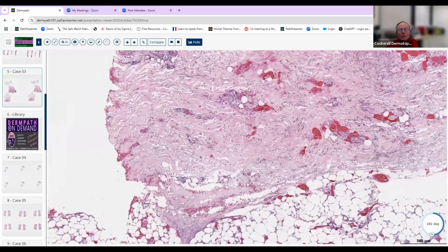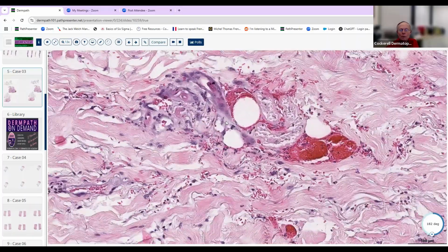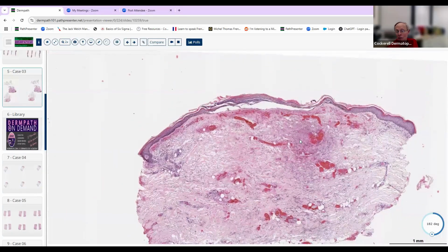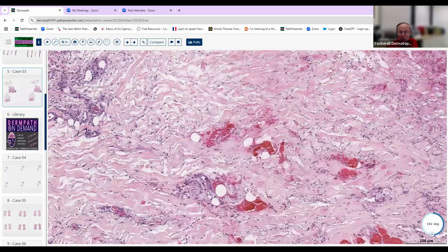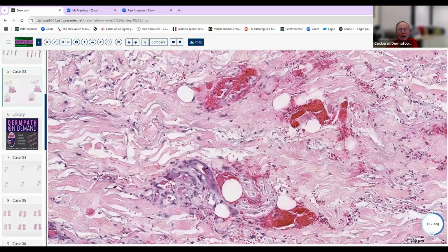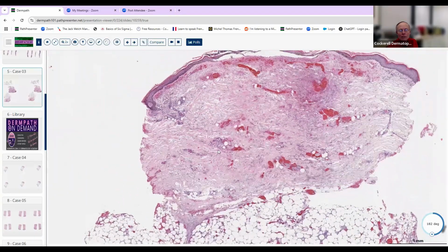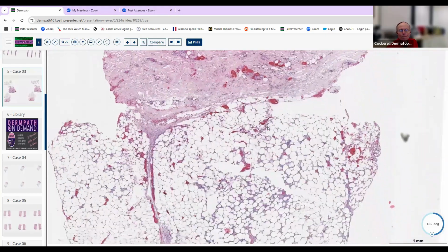So this is an ischemic process here. And let's say that you're looking at something like this, and maybe the differential diagnosis is between, say, an exogenously induced epidermal necrosis, maybe somebody applied a chemical or scratched the area, something like that. If you want to say, well, is it real or is it fake, and you see necrotic sweat glands like this, it's real. It's almost impossible to scratch and kill your sweat glands down here. This is way too deep for that. So this isn't just a superficial excoriation that killed the epidermis. It actually was due to ischemic necrosis.